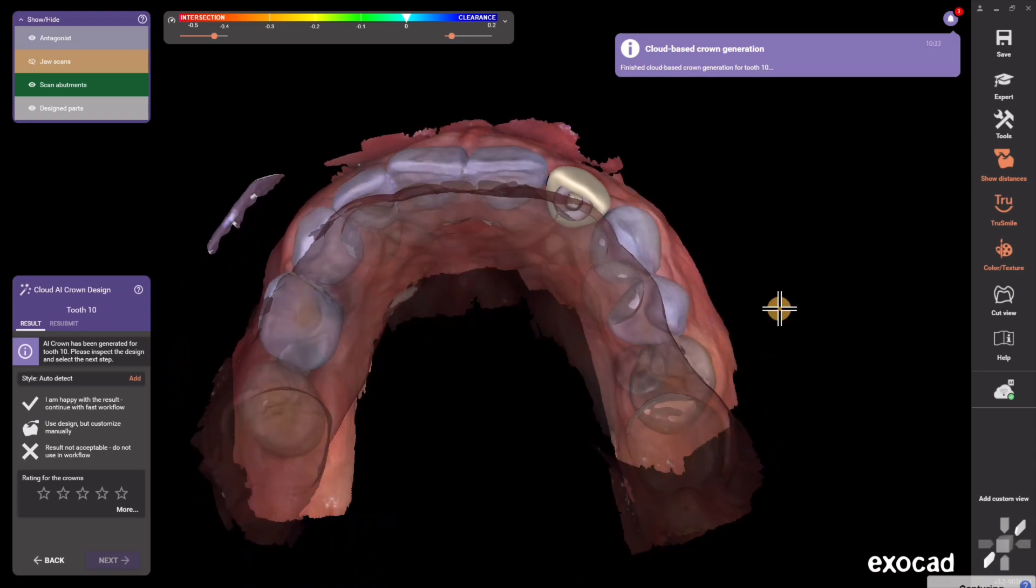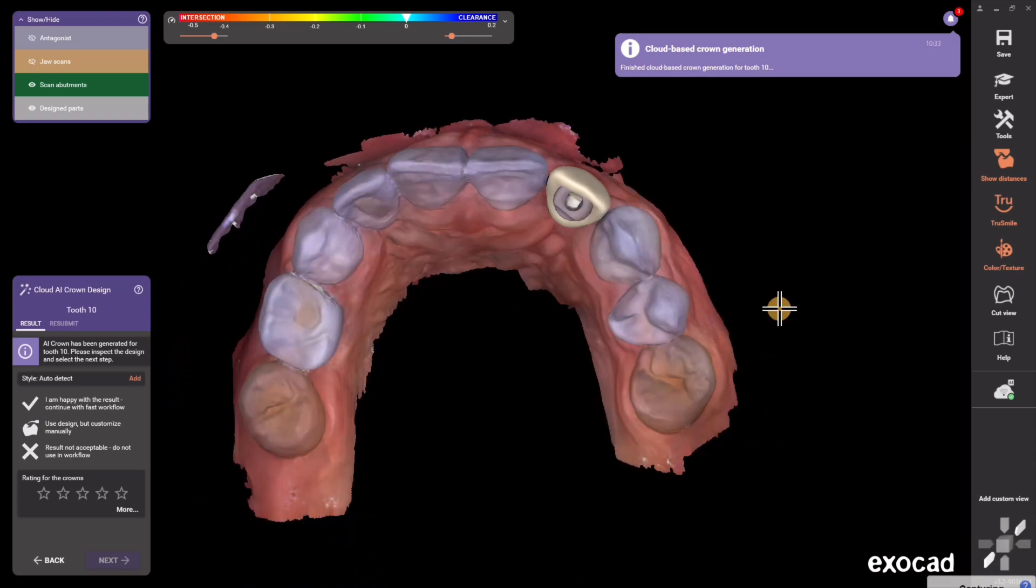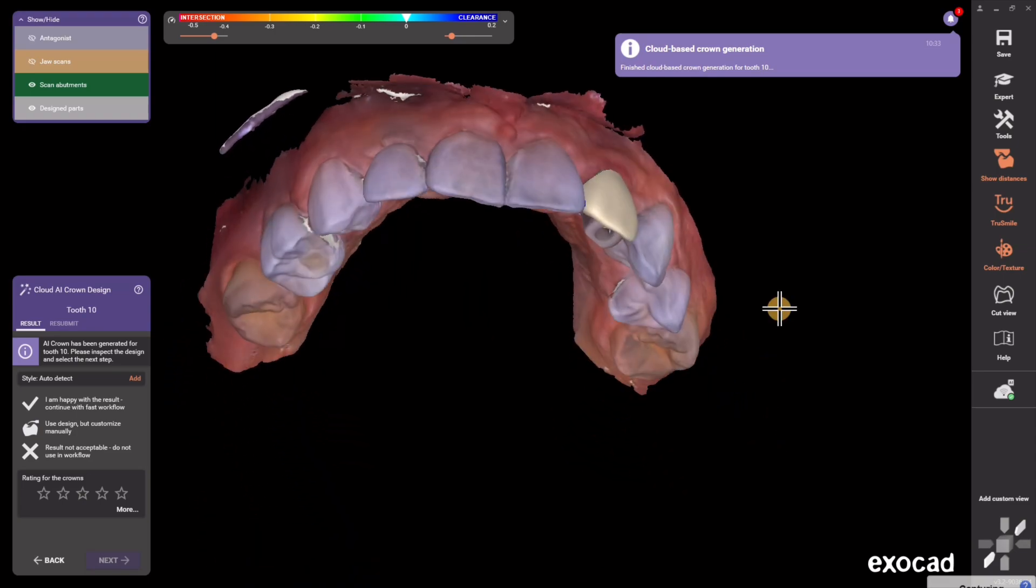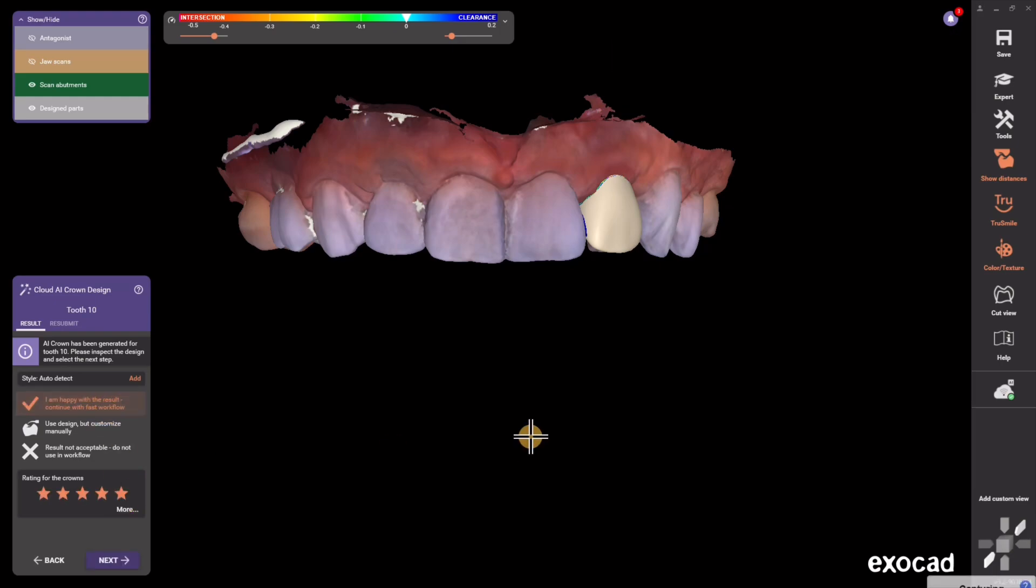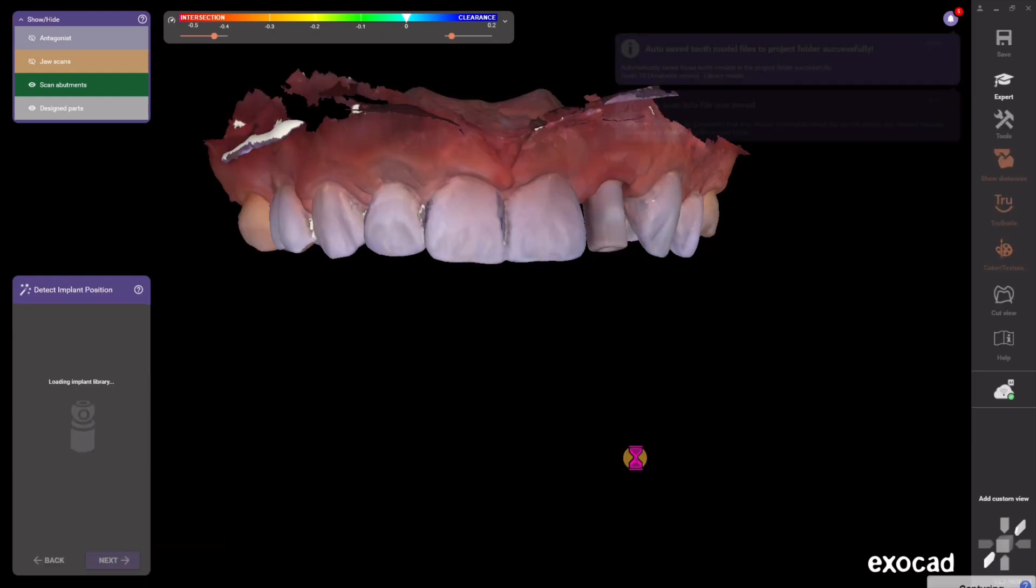It looks like it kind of mirror-imaged the contralateral tooth automatically for me and put it in there. So I'm going to give it the full star review and hit the little checkbox at the top and hit Next.